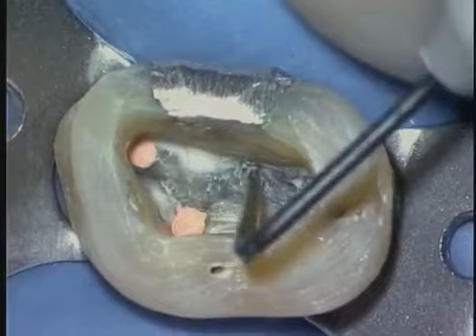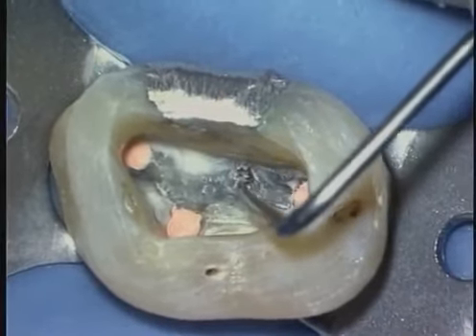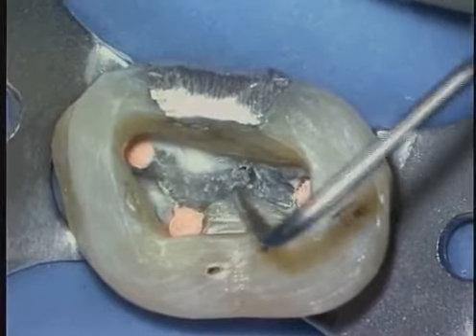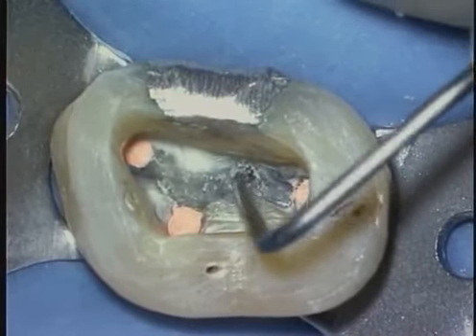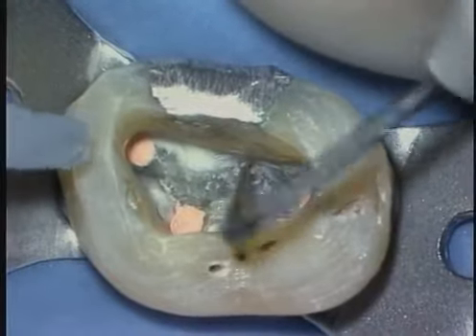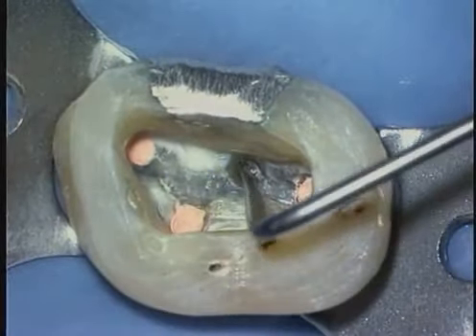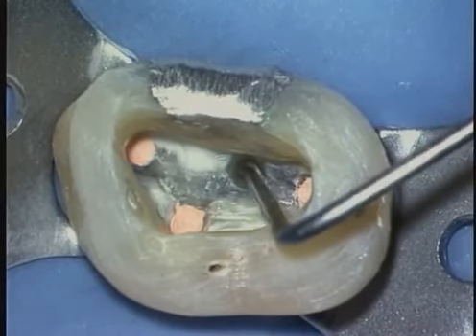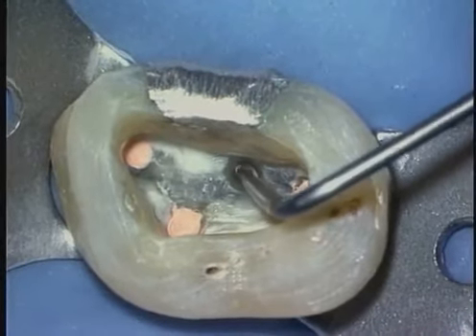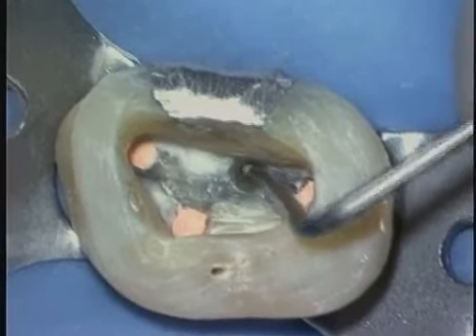The micro opener is an excellent instrument and can be used to begin to open up the mouth of the canal. Moving the instrument and cutting towards the buccal and then cutting a little bit towards the palatal begins to funnel the orifice level so that the instrument can proceed a little bit deeper. Again, the Gates Glidden are used not to travel down the root, but just to be kept and limited to the level of the orifice. By facing off the orifice and removing more restrictive dentin, the micro opener can now pass in deeper.